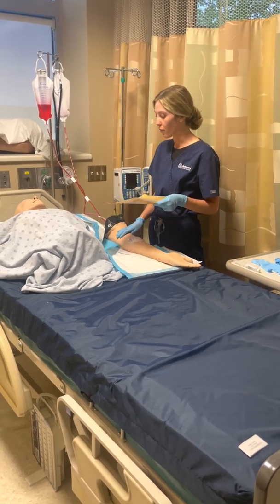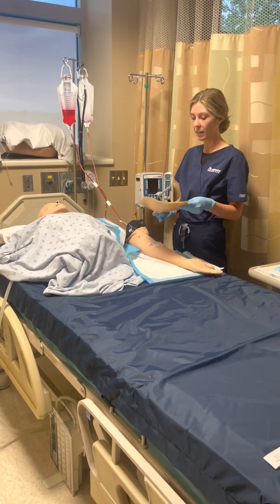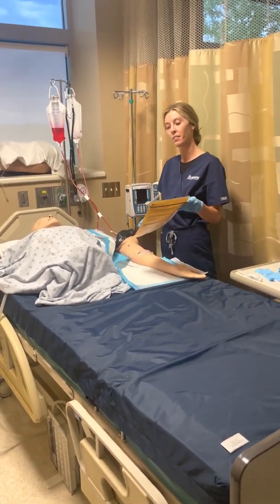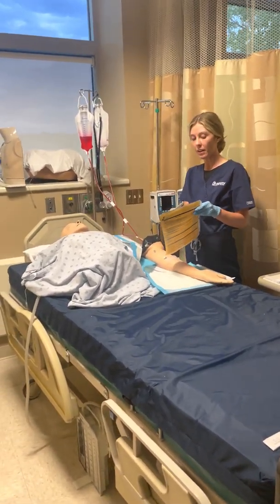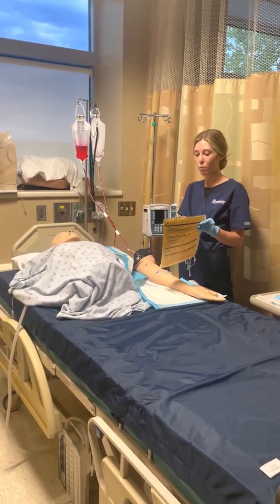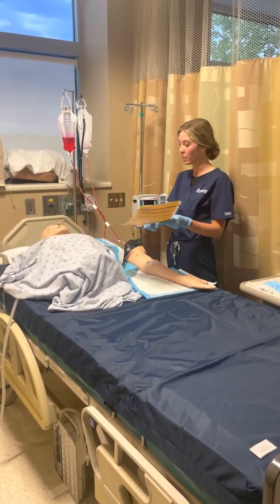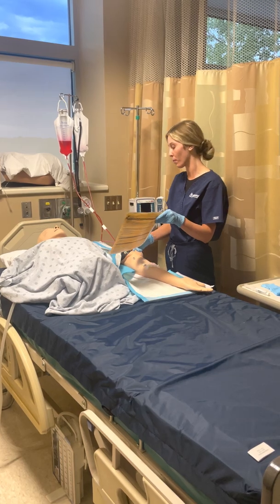So before we get any further, Betty, now that the doctor has explained everything and you feel like you have a good understanding of the procedure, I do just need you to sign this consent form. On here it says that you, Betty Jones, have authorized Dr. Avery to provide 1 unit of packed red blood cells today, and he has signed it. So I just need your signature, and then this consent form will be complete.